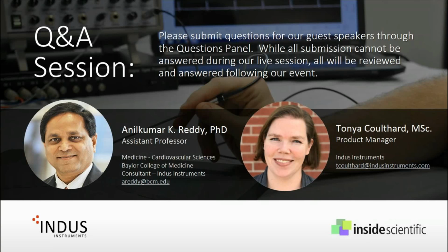But as Anil was talking about, we're able to acquire the same cardiac and peripheral measurements on rats upwards of 300, 400, 500 grams. So a 50-gram mouse would just be treated as a large mouse or a very small rat. So it would absolutely be possible using the system.